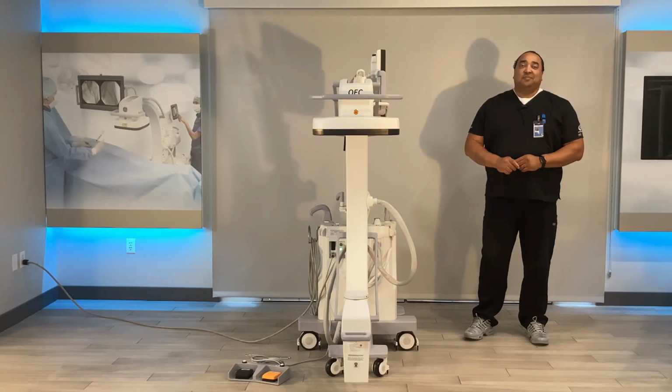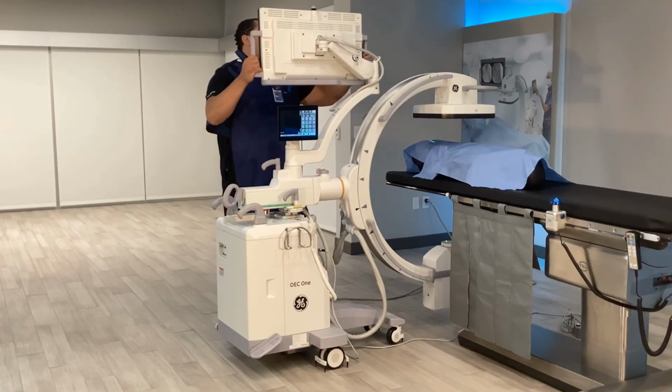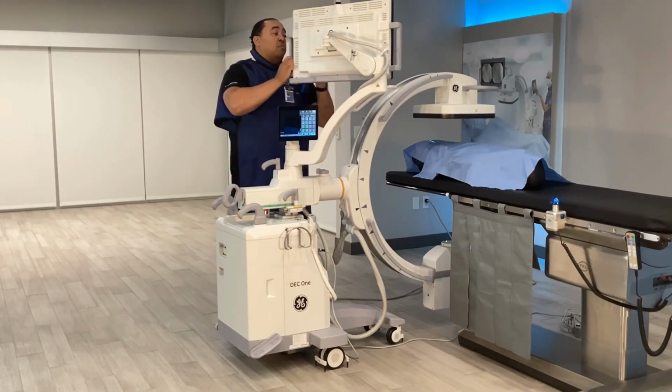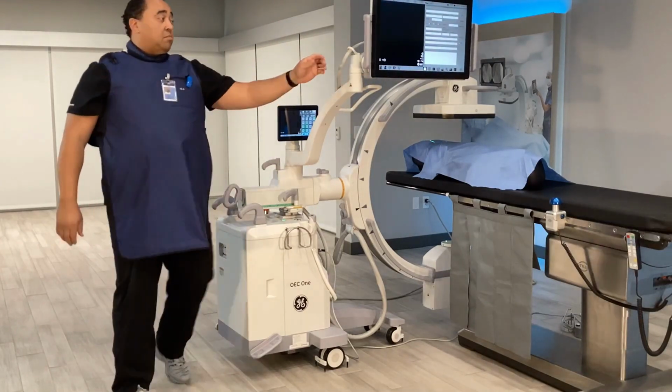This video will review monitor positioning for the OEC CFD. The monitor is mounted on an articulating arm and viewable from all four sides of the C-arm. Position the monitor by crossing the articulating arm above and within the C-arm footprint.